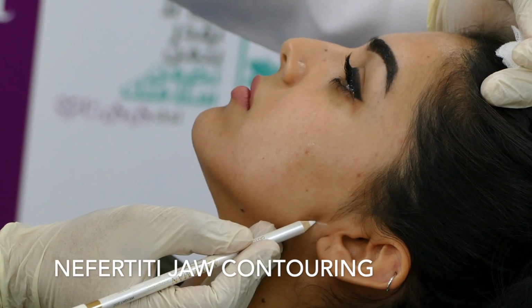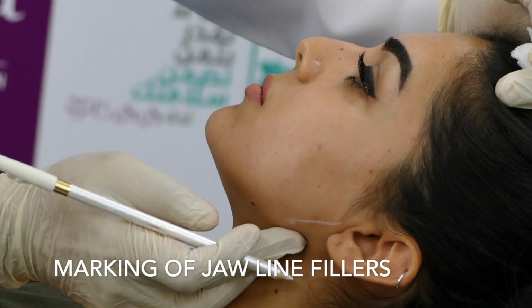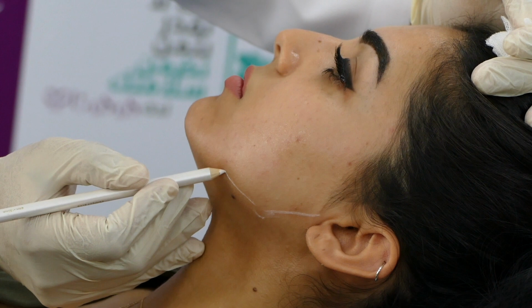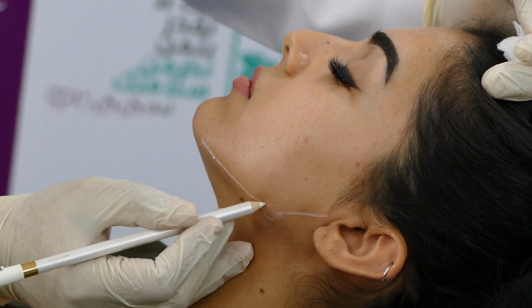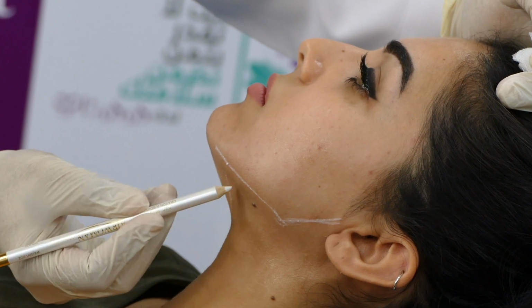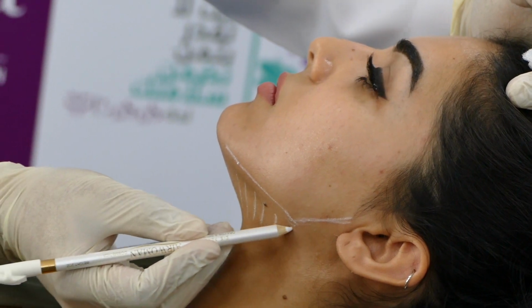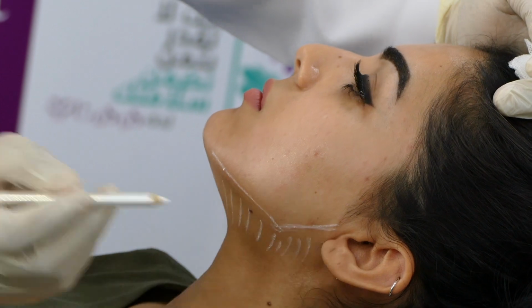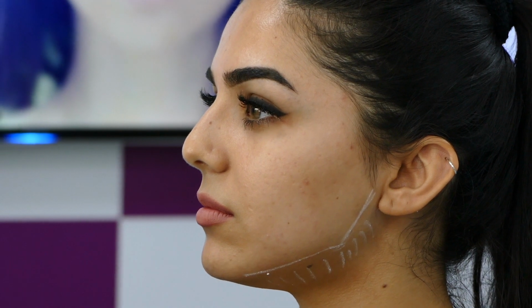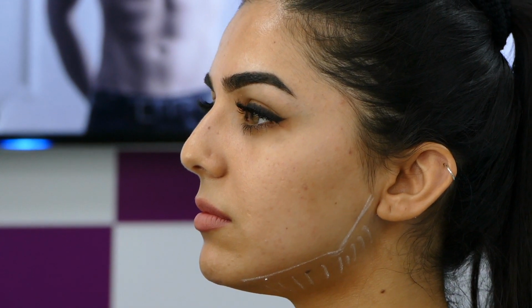Nefertiti jaw contouring is a combination of filler injection and botulinum injections. So I'm marking the jawline, I'm marking the vertical ramus of the mandible and horizontal ramus of the mandible, and then the platysma muscle which extends the submandibular region. Now this is a pretty good looking young girl who is asking for more definition to the jawline.